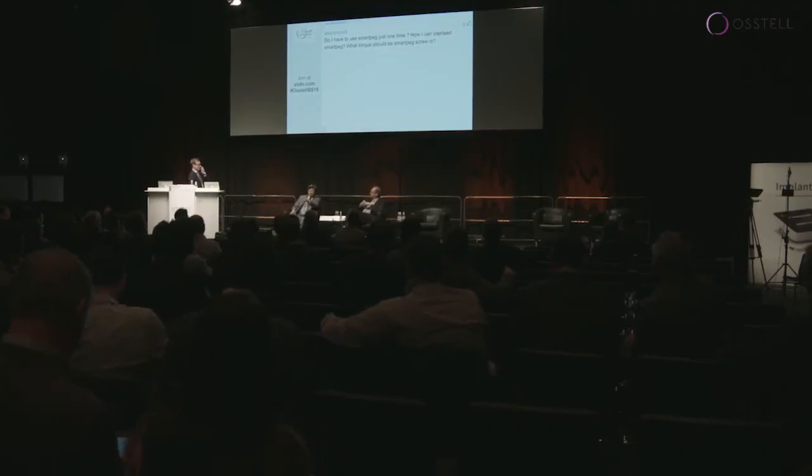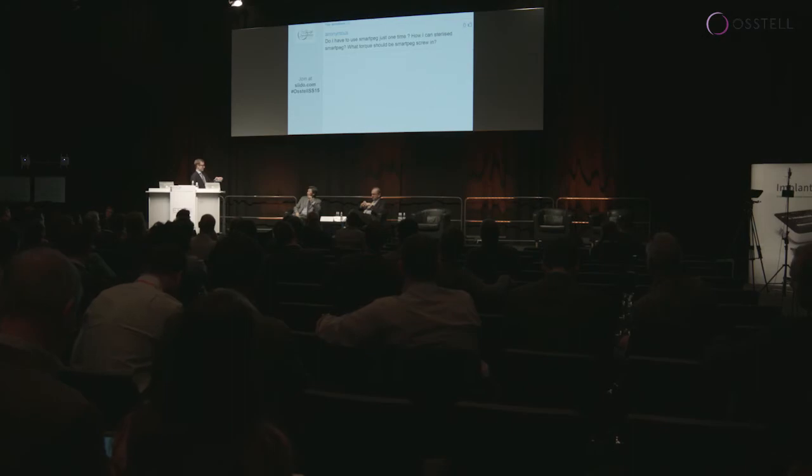In terms of the actual instrument, could you touch upon that, Peter? Yeah. First of all, you have to realize you cannot sterilize the SmartPeg, because that is where the magnet is, and if you try to sterilize it in a steam sterilizer or a heat sterilizer, you're going to destroy that SmartPeg. So do not try to sterilize it.